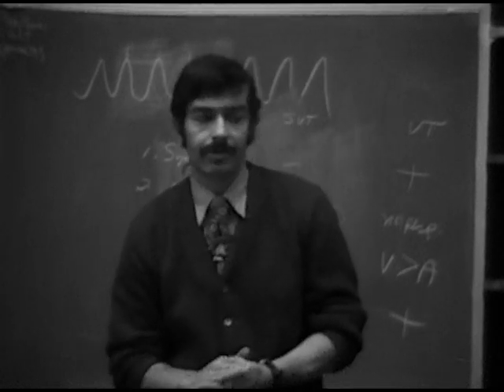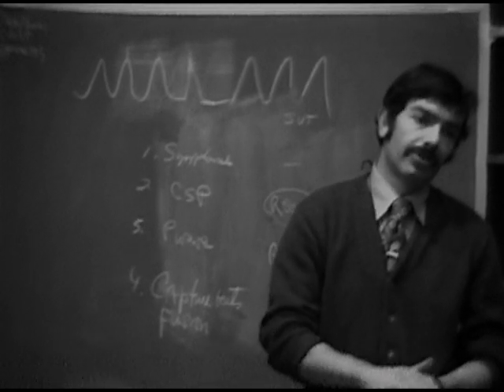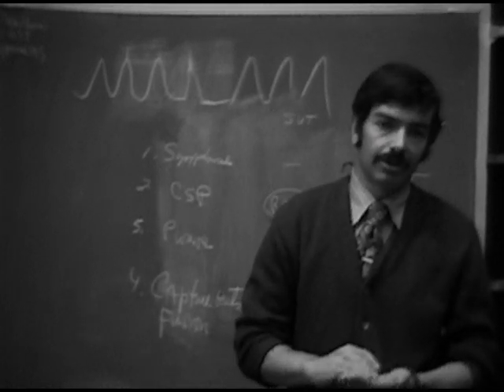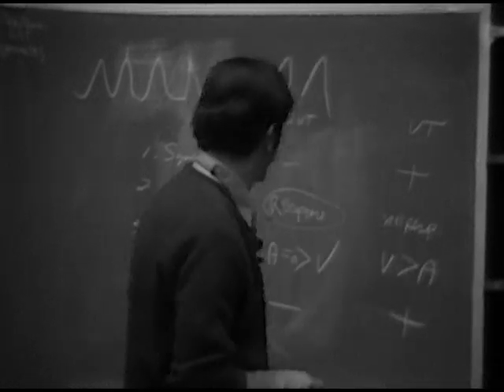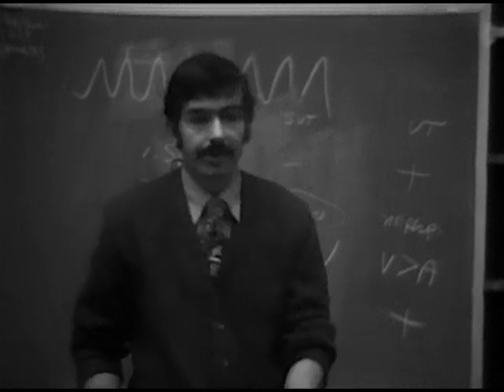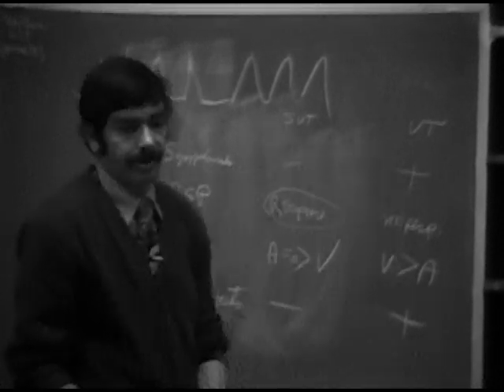When you have something like a nodal rhythm with an AV dissociation, with your nodal rate going at 80 and your atrial rate going a little bit slower than that, then you may see your capture beats occurring at very regular intervals. But at these rapid ventricular rates, it's unusual, though possible, that you may see regular capture or fusion. One of the problems is that ventricular tachycardia itself is not perfectly regular. And some people use that as a differentiating point between supraventricular tachycardia and ventricular tachycardia.